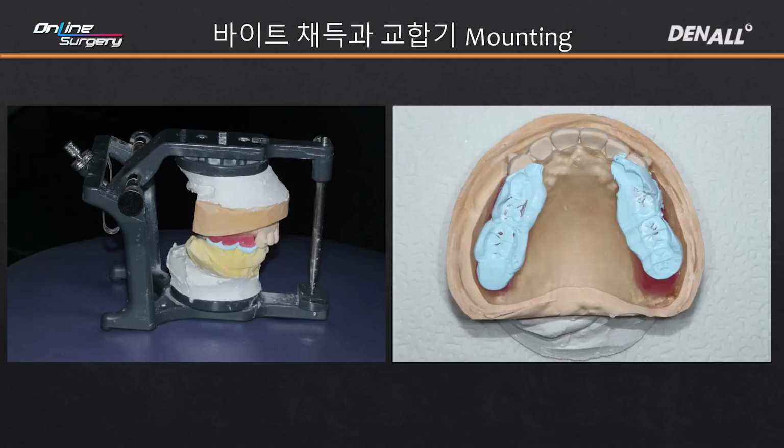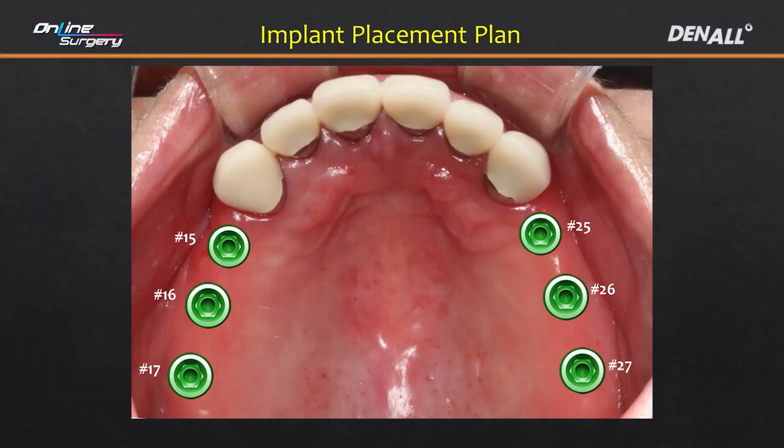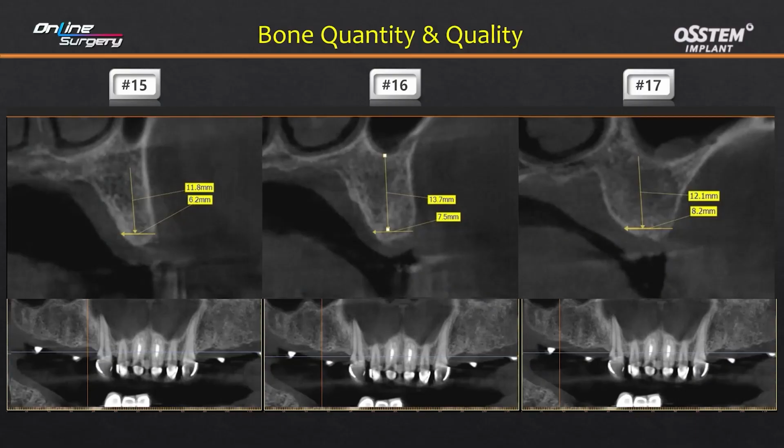If you come across such an extensive case, you need to provide accurate bite information along with the primary model to be able to do accurate guided surgery and provide provisional. Bite records were provided to OSSTEM Center in order to do guided surgery. The plan was to place 3 implants each because the patient had small arch, although the patient only had 6 anteriors. As shown on the CT, the patient had very good bone quality, but it was very unfortunate that the patient had no teeth. In number 15, bone quantity seems slightly lacking, but overall, the bone quality and quantity was very favorable.